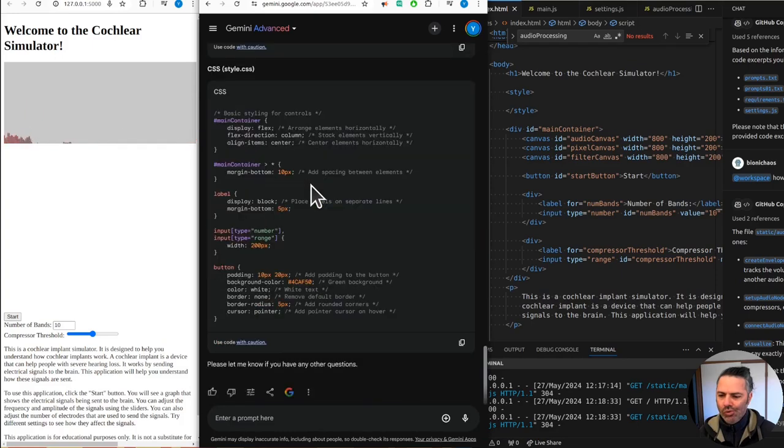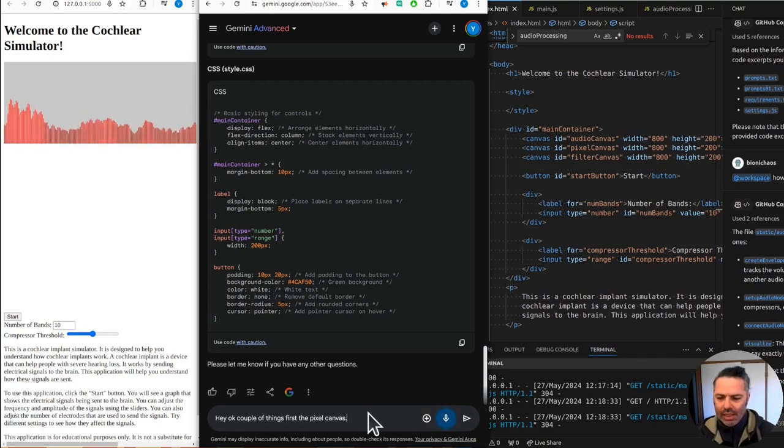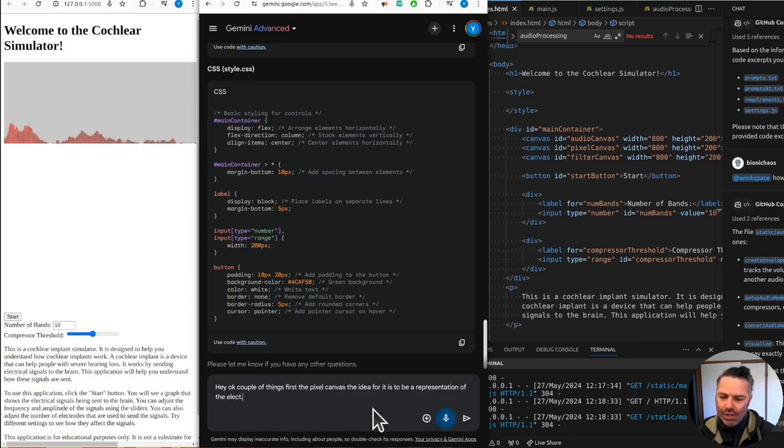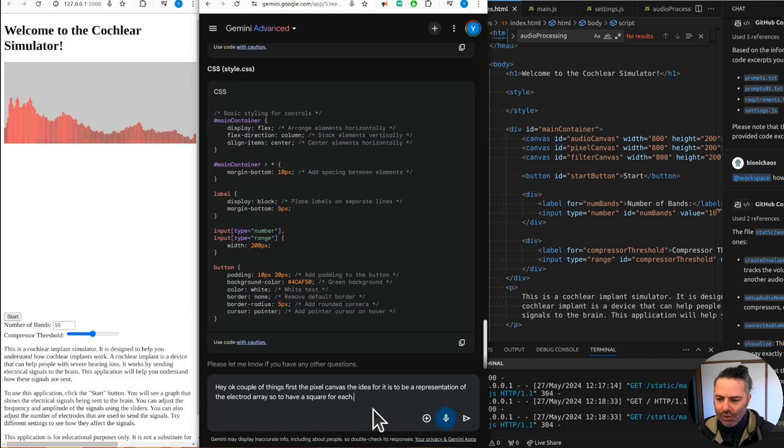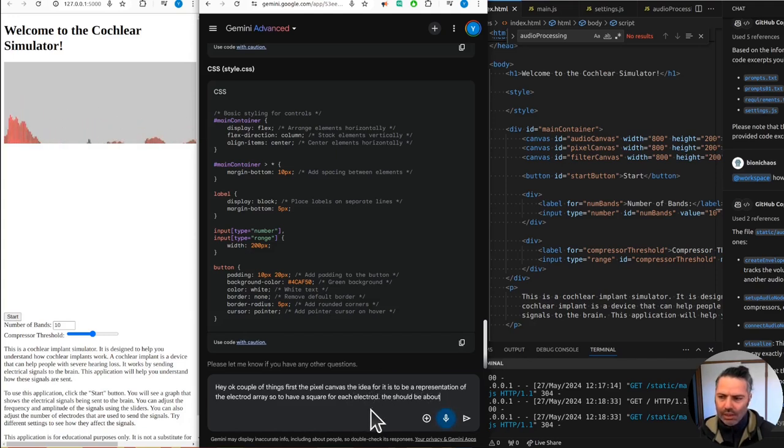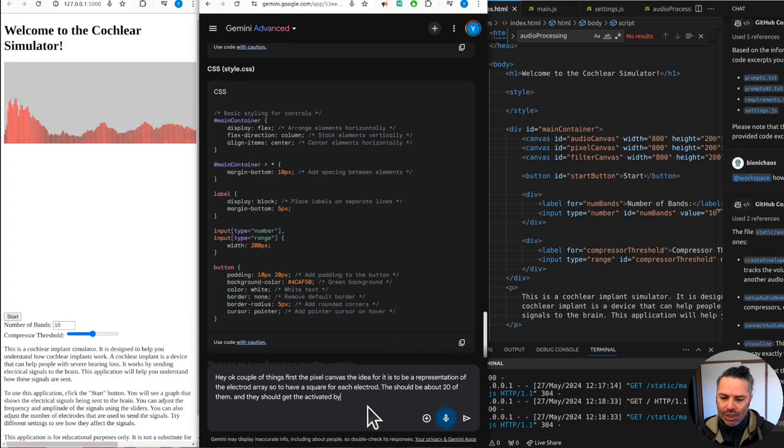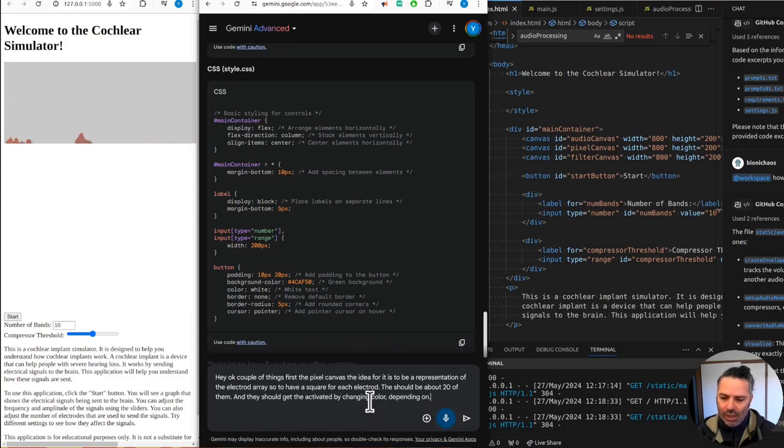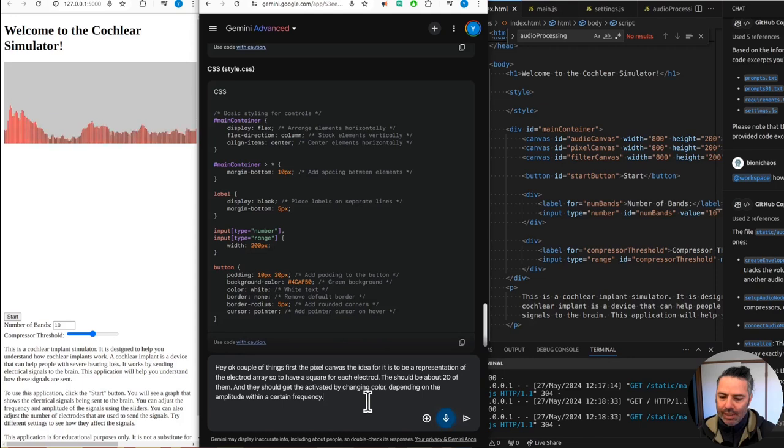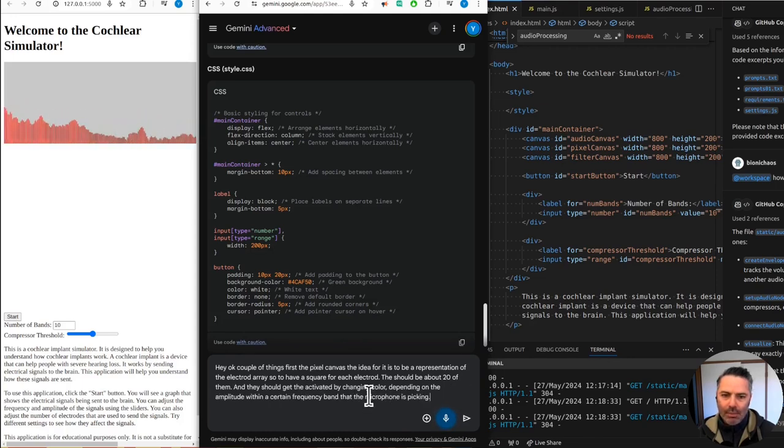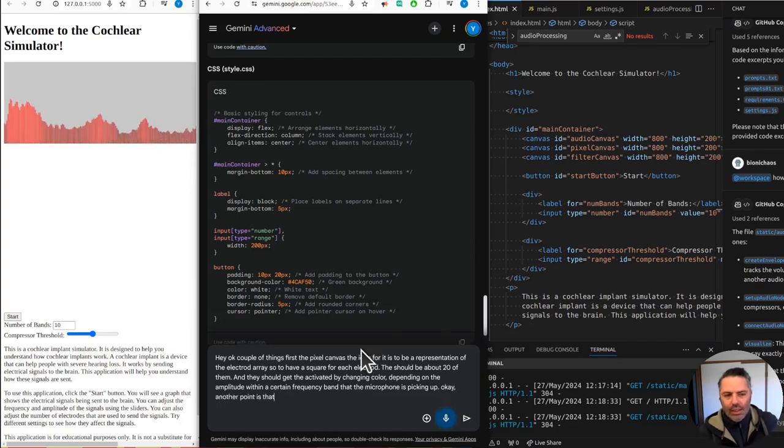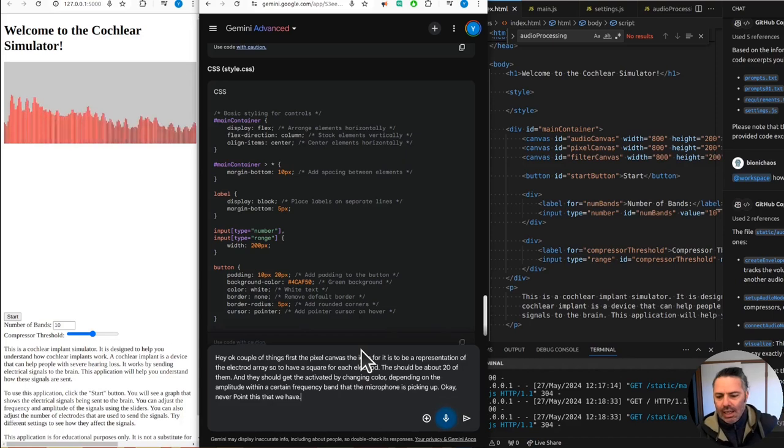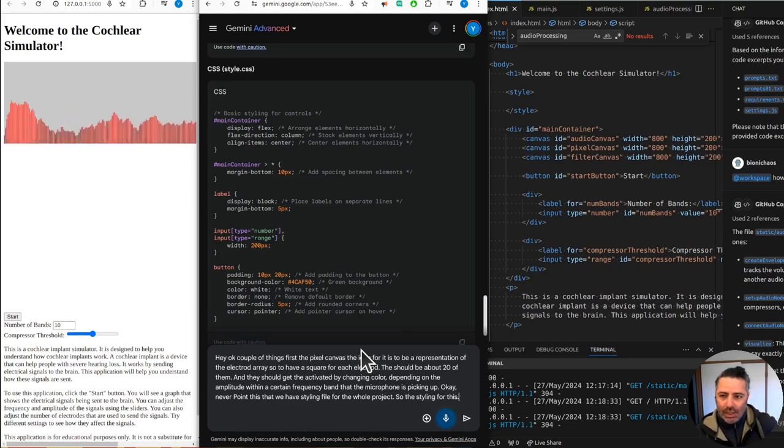First, the pixel canvas, the idea for it is to be a representation of the electrode array. So it should have a square for each electrode. There should be about 20 of them and they should get activated by changing color depending on the amplitude within a certain frequency band that the microphone is picking up. Another point is that we have a styling file for the whole project, so any specific styling for this application should be done within the HTML code.